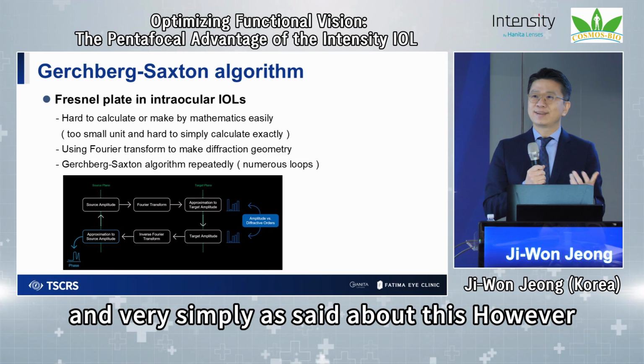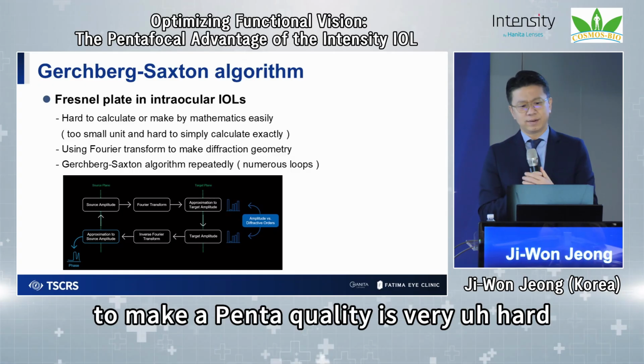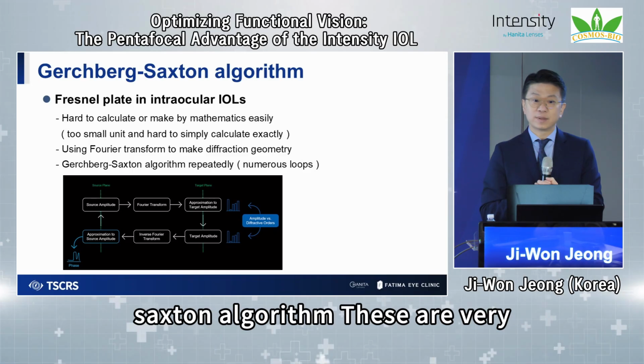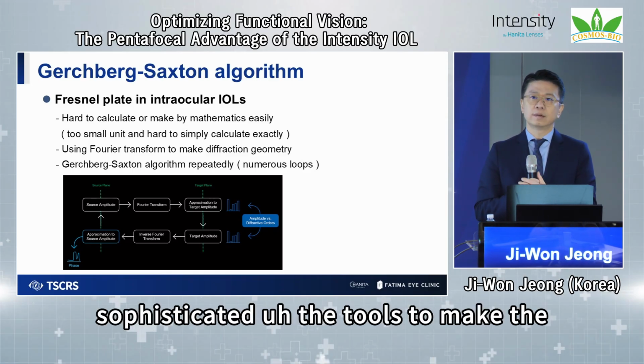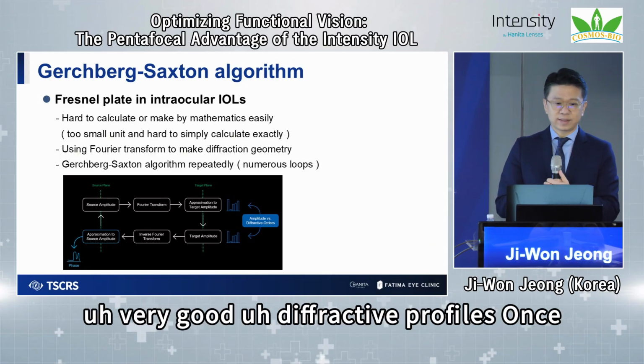Very simply said about this. However, making a pentafocality is very hard. So Intensity uses the Gerchberg-Saxton algorithm. These are very sophisticated tools to make very good diffractive profiles.